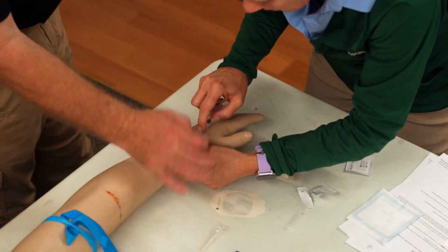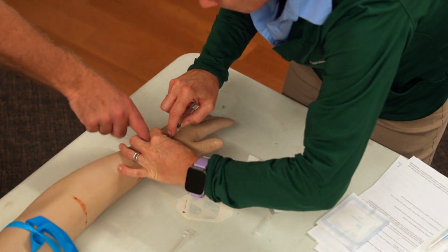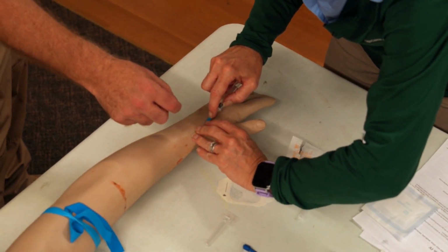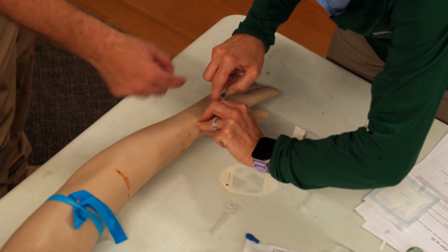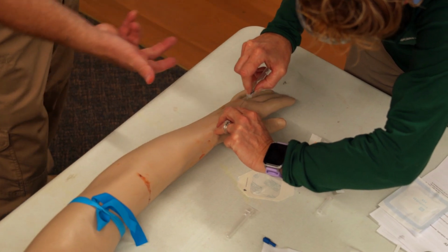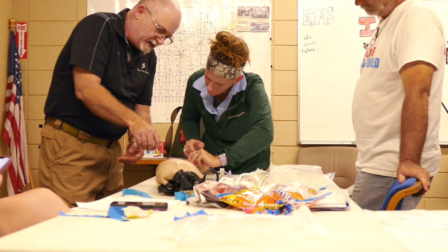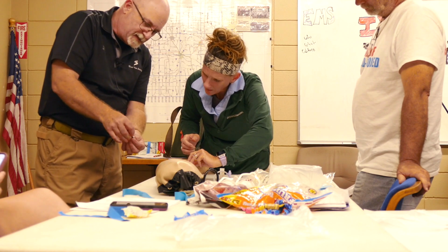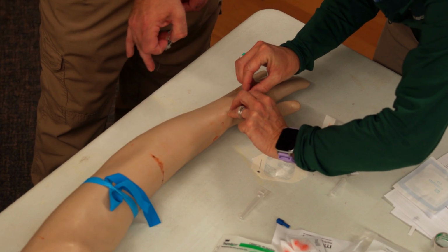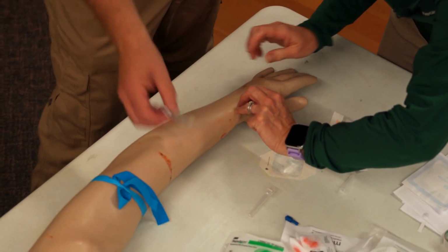You could do that, or if you want, try this. Grab your hub, take these fingers and push on the vein. Oh, that's awkward. It is awkward, but, or, there you go. Now pull these 2 fingers back, or do that. So otherwise what you can do is, while you're in, you pushed. Yeah. So you're pulling back with that, and then go ahead and hit the white button if you want to make that go backwards. There you go, that's gone.